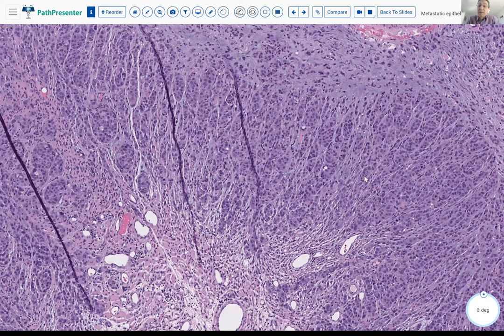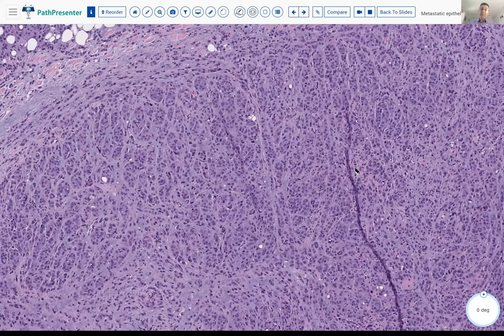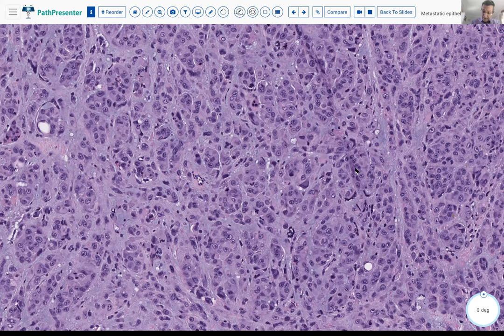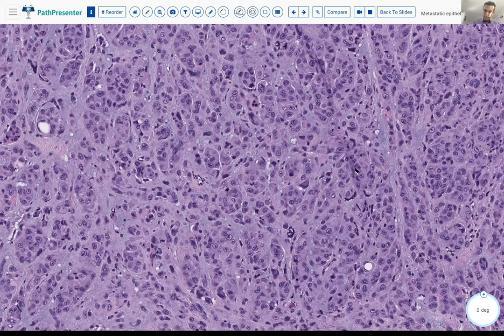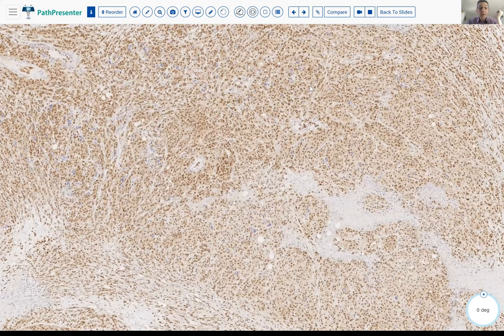If you don't have the clinical history, you might think about a distant metastasis from carcinoma or a sweat gland tumor infiltrating deeply into skeletal muscle. Immunostains show negative for S100, negative for desmin, and keratin positivity — so you go down the carcinoma route. TTF-1, PAX8, and other markers are all negative. You might call it metastatic carcinoma of unknown primary — and you would be wrong. The stain that reveals the true diagnosis is ERG, which is diffusely positive here.